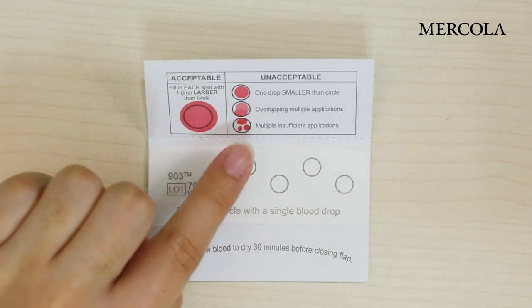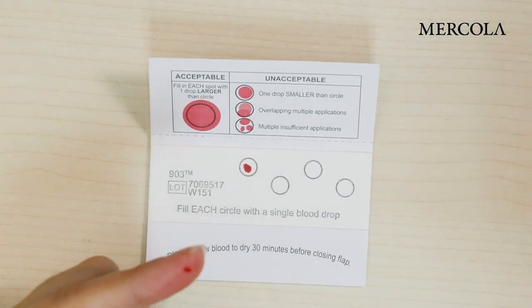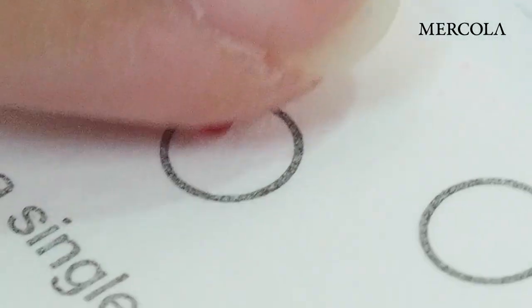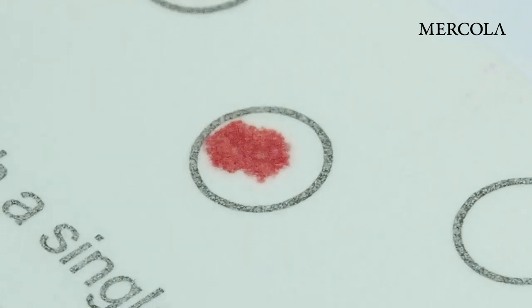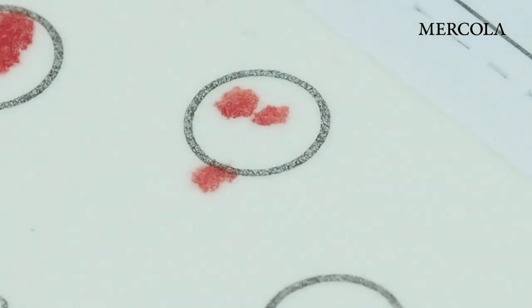These are examples of unacceptable blood spot cards. The first one does not have enough blood in it — the blood spots are too small. The second one has overlapping drops, which is also unacceptable. The third one is also unacceptable because it has not soaked through the back.